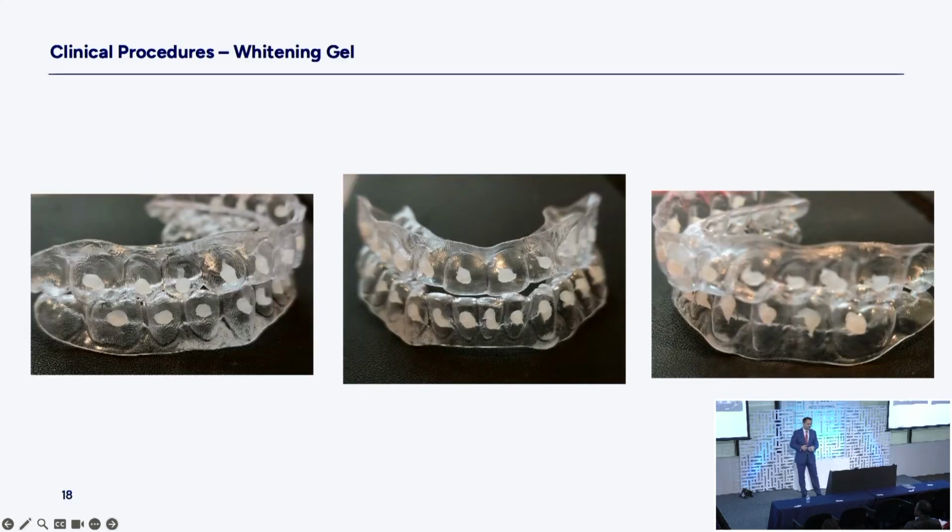So you deliver the whitening gel. What's it look like? This. We show them how to do it. So you could take a picture of this. Now, I won't show them how to put it in every single tooth in their aligner while they're in the office. I show them one tooth. I get out the gel, I take a sample aligner, I don't use their own, I have a sample aligner handy, and I say, let me show you how to put the gel in there.